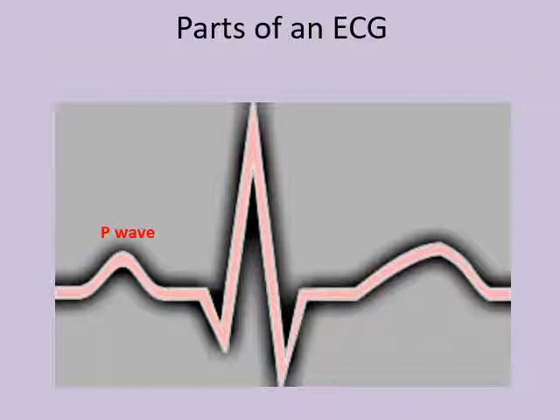This whole thing is showing you when the ventricles are contracting. So this has a cute little thing to it. This is the Q, so this part here is Q. That's the R, and that's the little S point, all right? So the QRS. And this whole little QRS is called the QRS complex. So this whole QRS complex is when the ventricles are contracting.